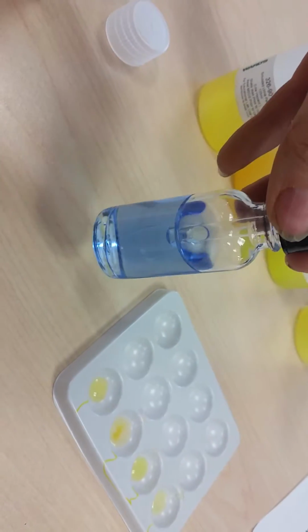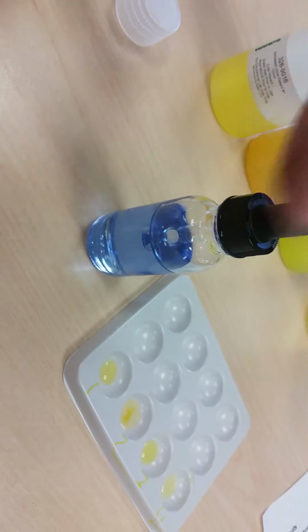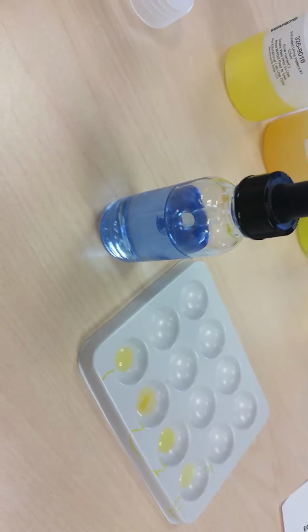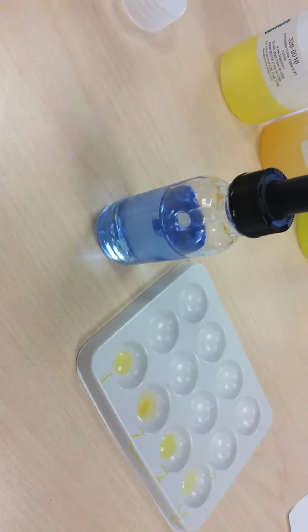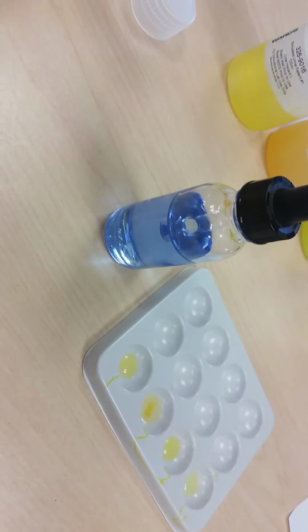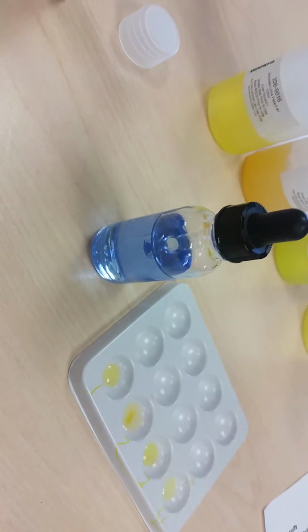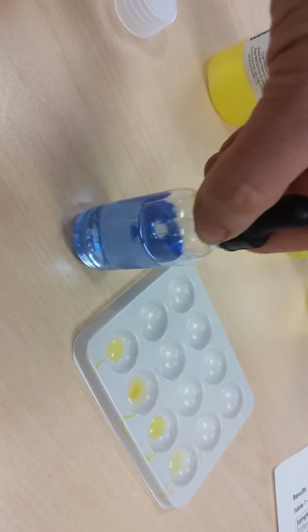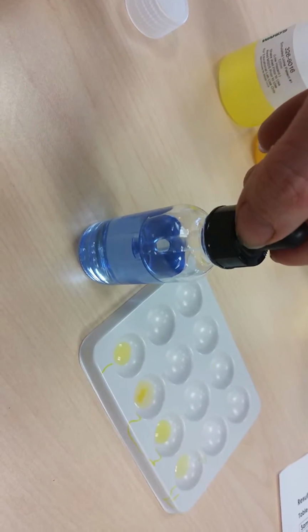This blue solution is called Biuret reagent, and it turns a purple violet color when it comes in contact with peptide bonds. And if you remember when we learnt about amino acids, which make up proteins, when they join they form a peptide bond. So you don't find that in a carbohydrate or a fat. So when this changes color, it's a good indication that we have protein.